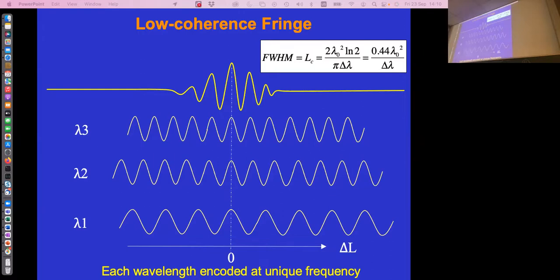That is actually very common. It's very difficult to make a narrow laser. So what in general happens is that you get a laser output that has these lines around the center wavelength, where you have maybe 5 different wavelengths coming out of the laser. It's very difficult to make a monochromatic laser. So in that case, yes, you get multiple wavelengths out of the laser. And with that there is also a coherence length associated, and this pattern then would be created. And from that laser, you indeed will see a repetition of that pattern. So let me put it this way, it's very difficult to make a continuous source that never repeats, because in a laser, you have a laser cavity, and the laser cavity already makes the spectrum a picket fence.